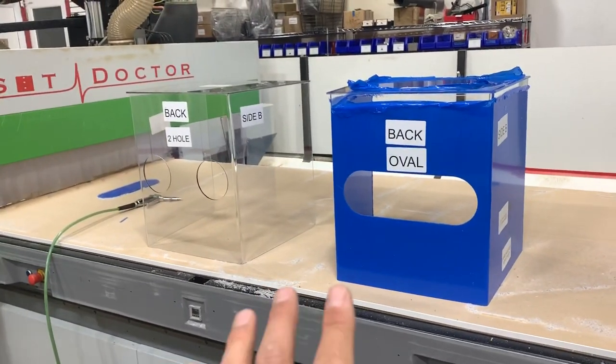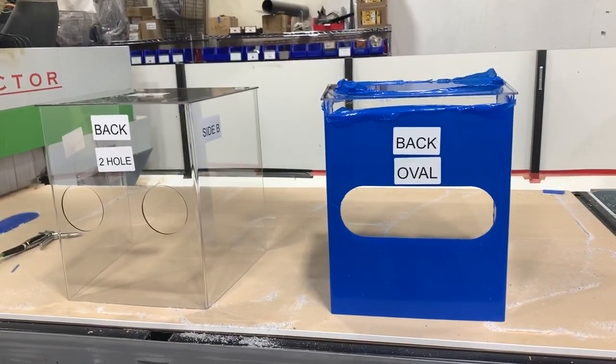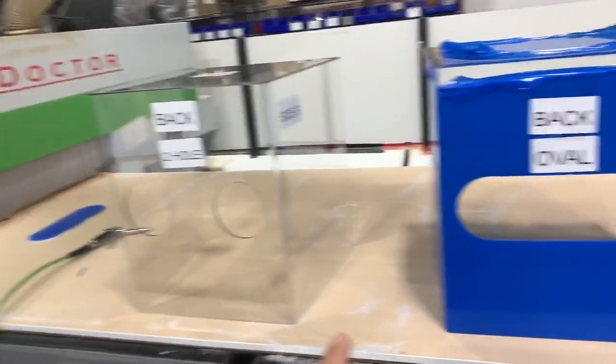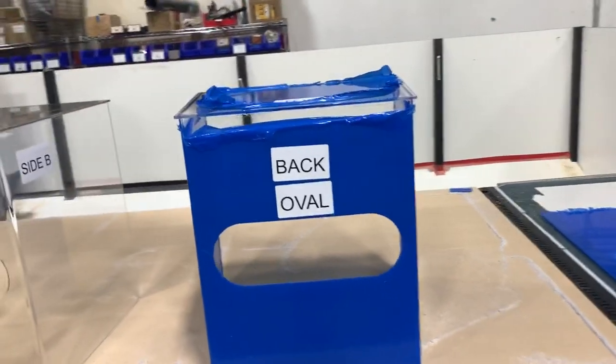Derek here with the Closet Doctor. In front of me I have our two prototypes for the aerosol isolation box. This one here is clear — I've highlighted the holes with a sharpie so they stick out, but it normally wouldn't have that. This one here, we've left the blue protective film on just so you can see it.